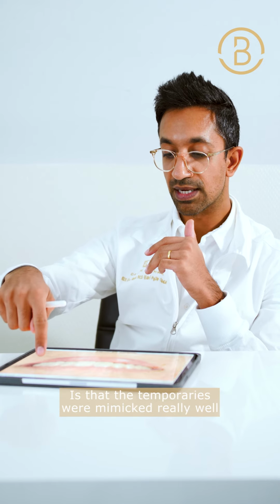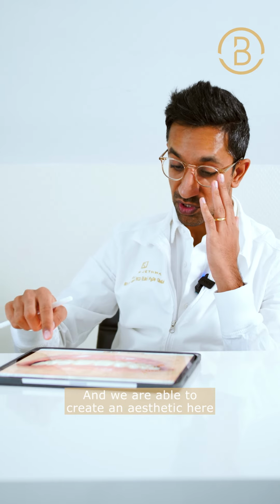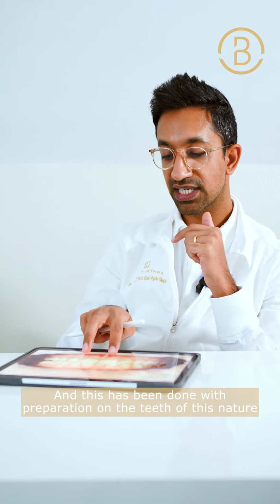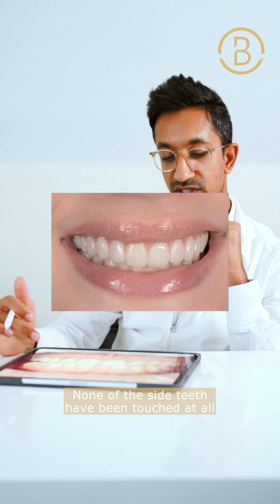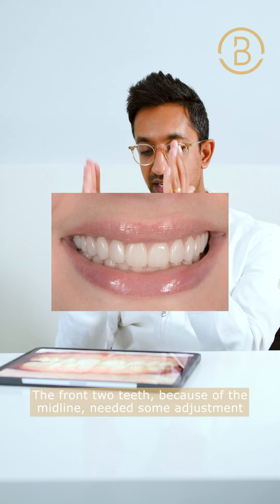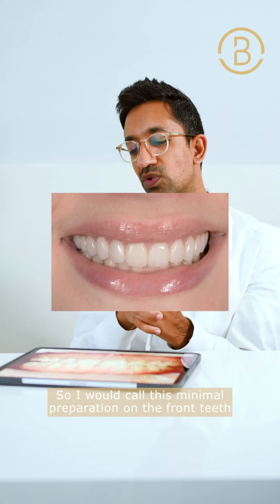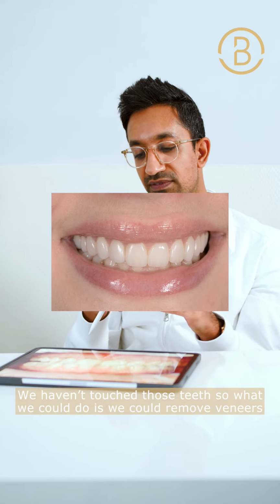And in her final result, what we'll see is that the temporaries were mimicked really well, and we are able to create an aesthetic here that actually flows nicely with the face. And this has been done with minimal preparation on the teeth of this nature. None of the side teeth have been touched at all. We have no preparation. The front two teeth, because of the midline, needed some adjustment in an extremely small amount of way. So I would call this minimal preparation on the front teeth and no preparation everywhere else. We haven't touched those teeth.